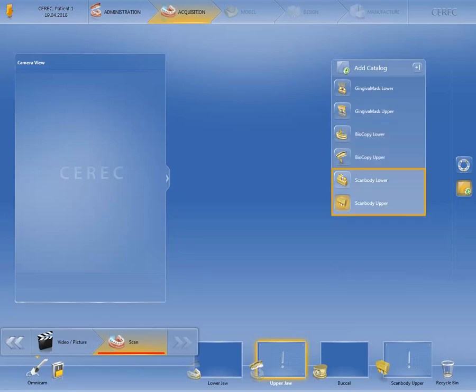The scan body lower and upper image catalogs are automatically selected for an implant case. When performing a scan for these, you have to make sure that the scan post itself, as well as the transition between gingiva and scan post, were captured properly and without interruption.